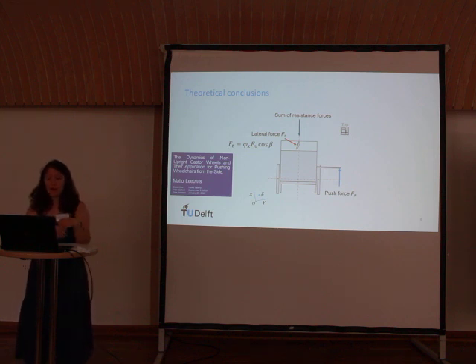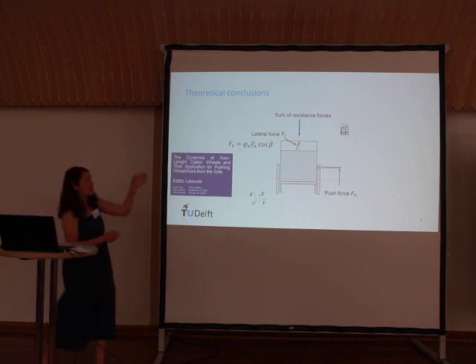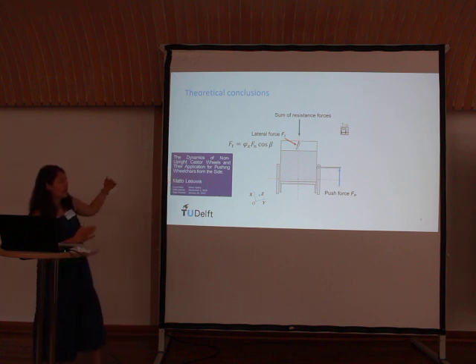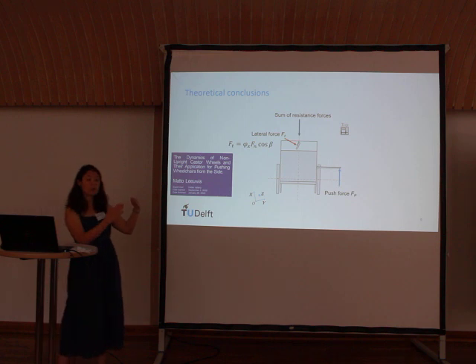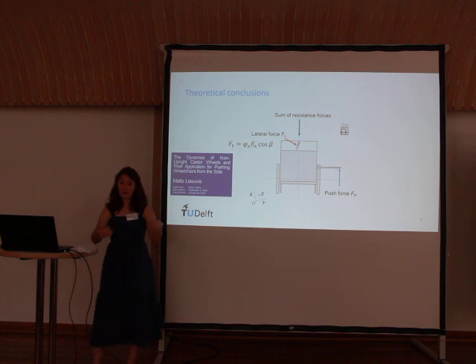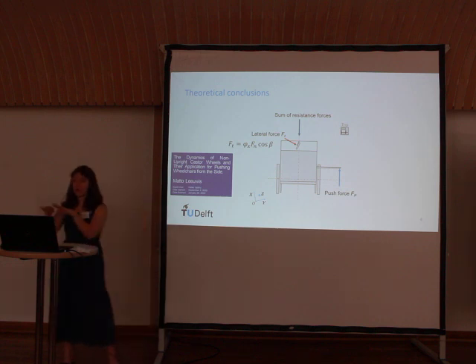And then secondly, because this lateral force, in this picture the wheel is at an angle, but the lateral force actually ends up being perpendicular to the push force, and this means that when you have a properly designed canted wheel in the front, you need the same amount of force to push a person forward if you're pushing from behind without that wheel, or with the wheel pushing from the side.